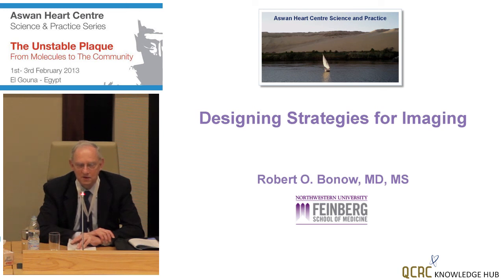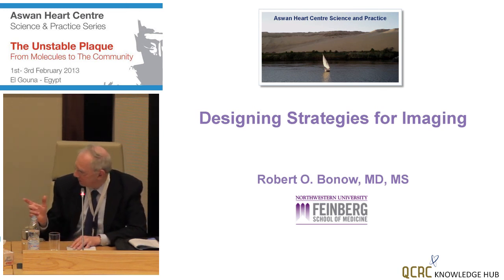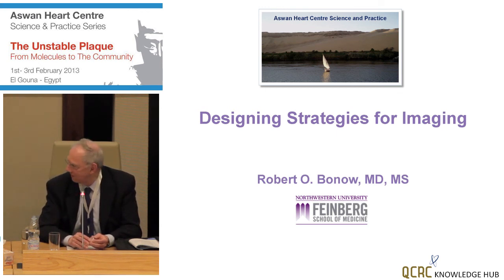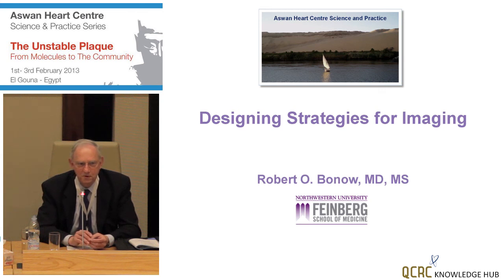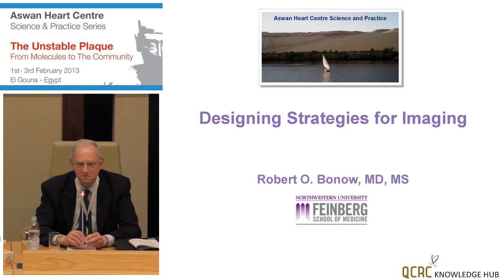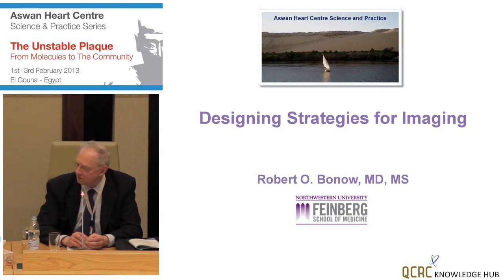And CT now allows us to do both in one test because we can also look at the non-invasive measurement of fractional flow reserve with CT, as we saw from a paper at the European Heart meeting last year. So the field is evolving, and I think we do need to ask the question, do we want functional assessment of ischemia versus anatomy? Can we do that in one test? Is that accurate? Is it cost effective? And most of all, does it lead to better patient outcomes? So again, we need more time to determine whether that's going to be the case or not. These are important questions, certainly in my country, and I suspect also in yours.